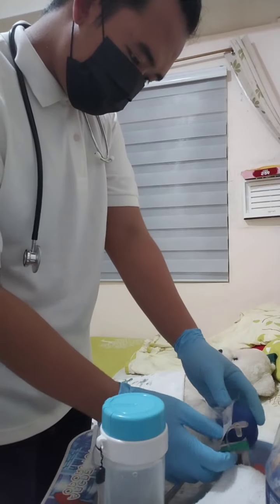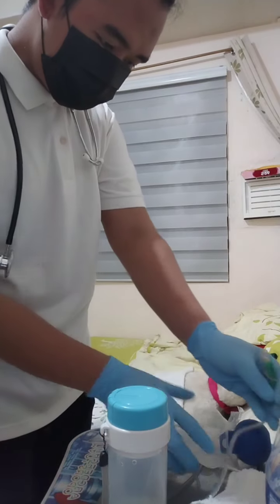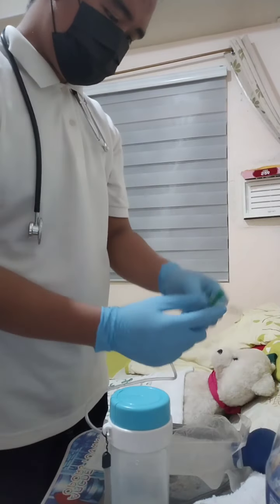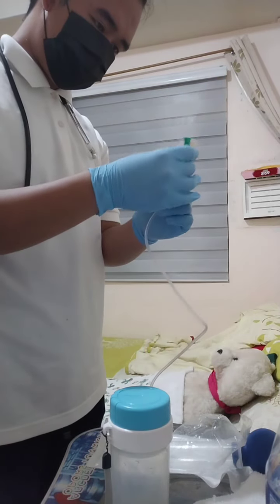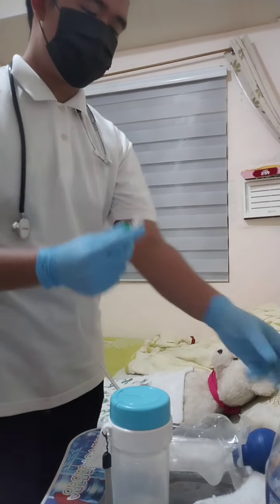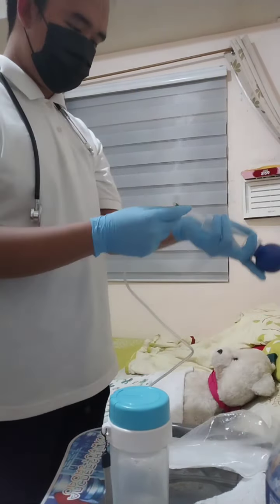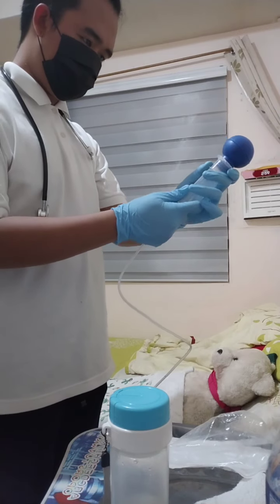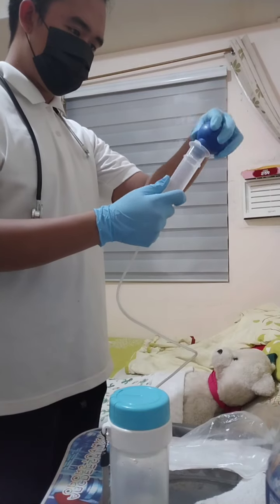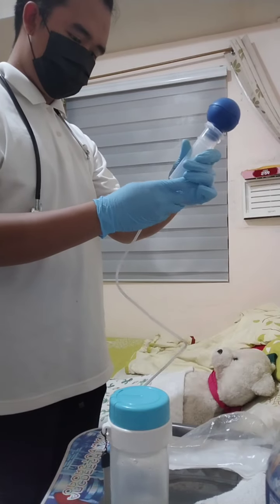Third, prepare the feeding container to administer formula. Have the tube feeding at room temperature. Cold formula may cause gastric cramping and discomfort because the liquid is not warmed by the mouth and esophagus. Connect tubing to the container as needed or prepare a ready-to-hang container. Tubing must be free of contamination to prevent bacterial growth.